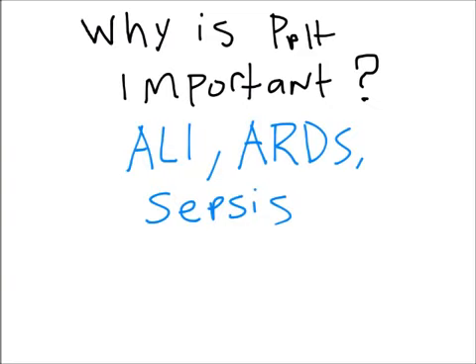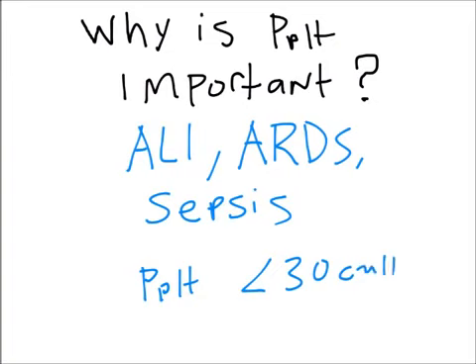And what we try to do is keep our measured plateau pressures less than 30 centimeters of water. And this is a guideline for lung protection.